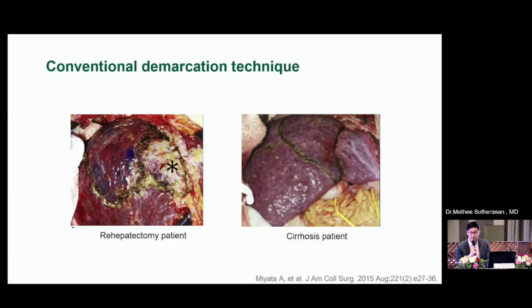But the main drawback, especially in repeat hepatectomy and cirrhotic patients, is that sometimes these techniques cannot clearly visualize the demarcation line.